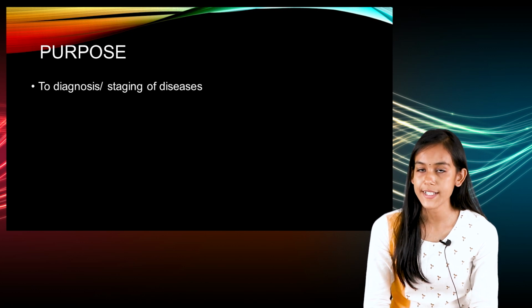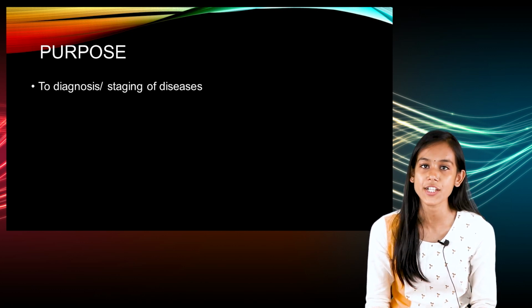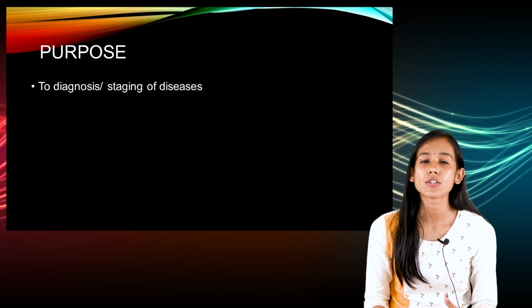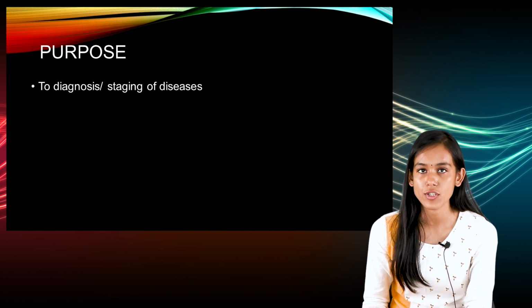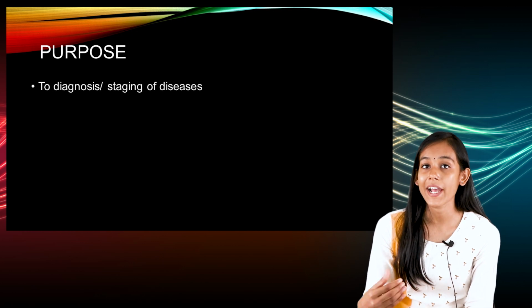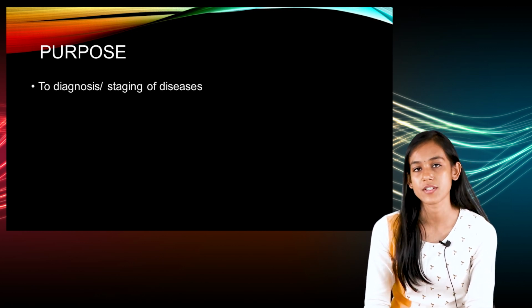For example, if there is leukemia or multiple myeloma, to determine at what stage the disease is, or as a first step to diagnose the disease, we perform this procedure.